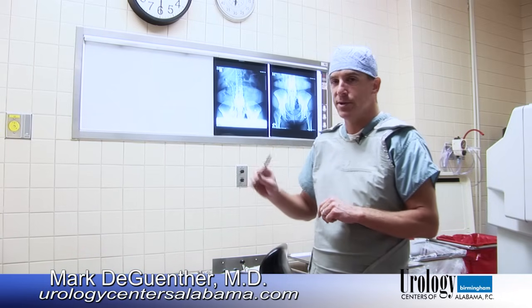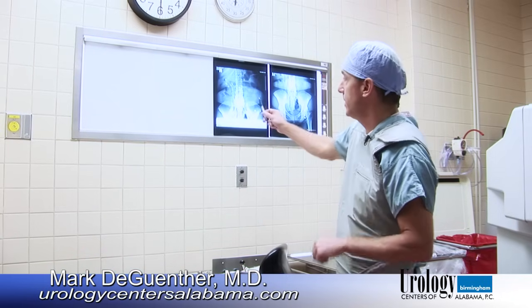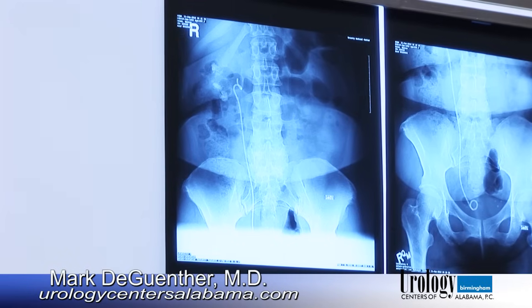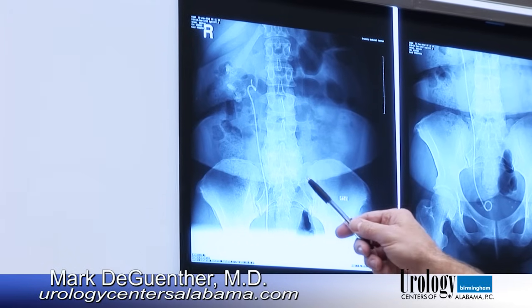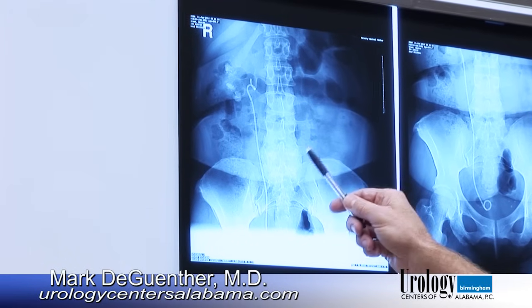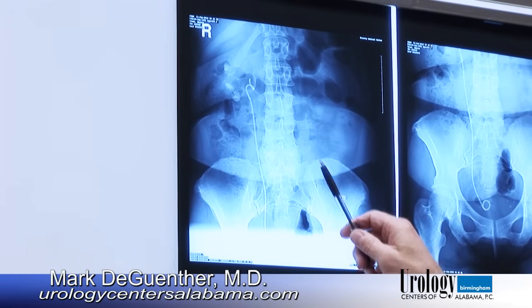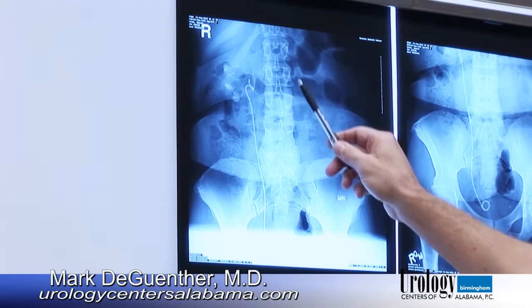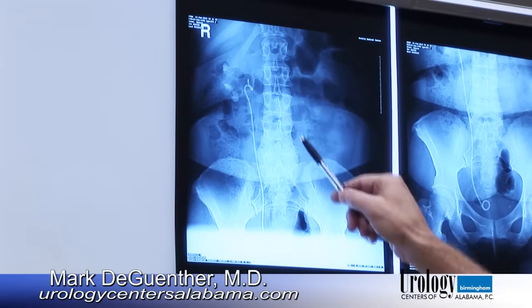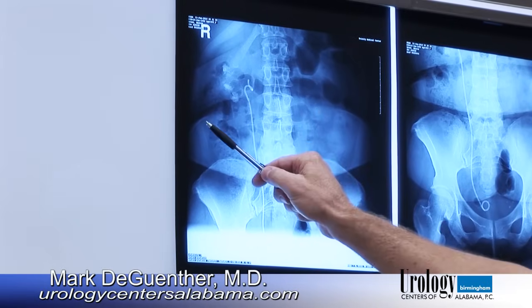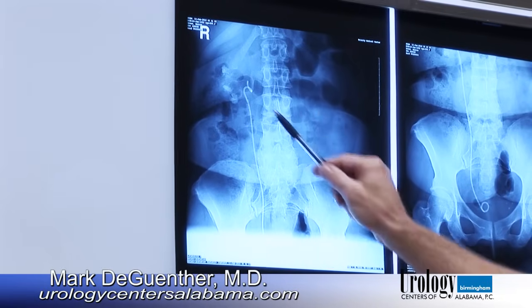I first want to show you the stones that we're going to be taking care of today. This is an x-ray of the patient that we're going to be doing today. This is the spine, this is the patient's right, and the patient's left.